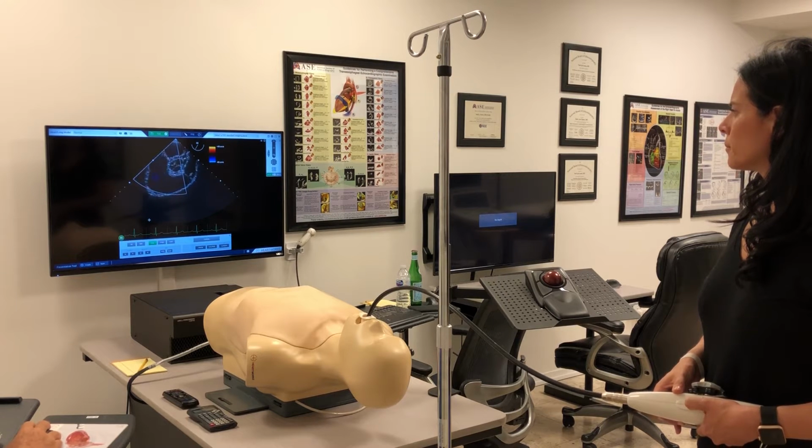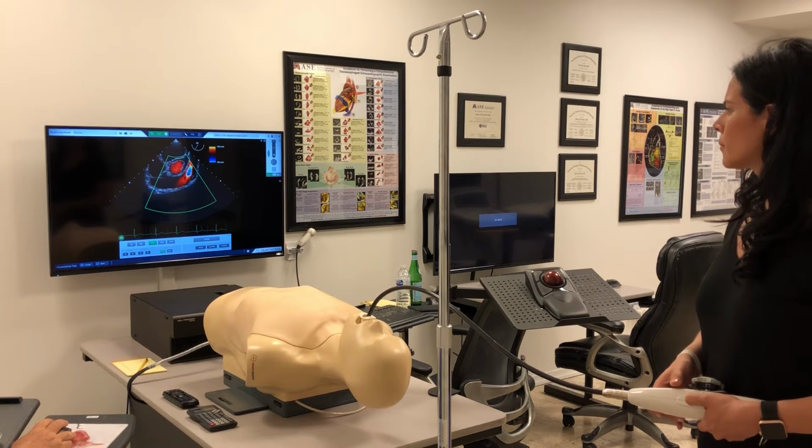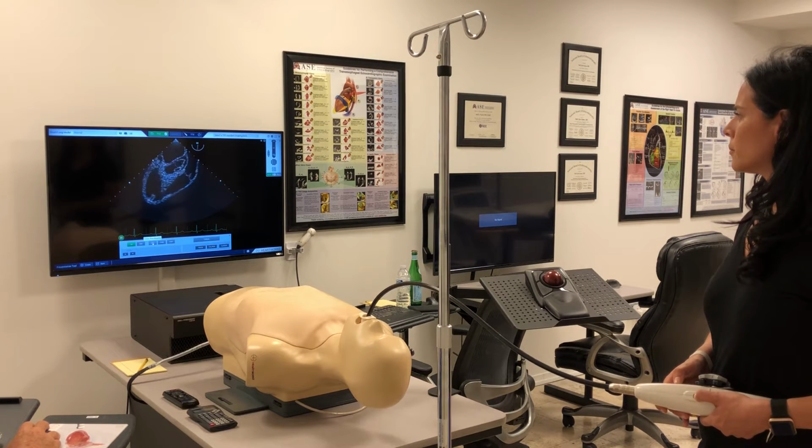We can quickly color the tricuspid valve looking for regurge. Don't see any. And then move our color box over to the pulmonic valve looking either for regurge or stenosis. Here there's no regurgitation and only the normal aliasing of forward flow. Good. Next view is just this view, but at about 120 to 140 degrees.